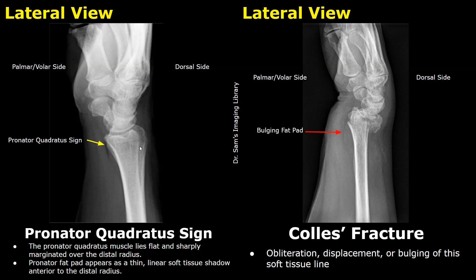Here is another example of the pronator quadratus sign. In normal cases we see a dark, linear, soft tissue shadow anterior to the radius, whereas in Collis fracture this line is bulging and somewhat brighter than the normal one. This line will be seen at the palmar aspect of the hand.